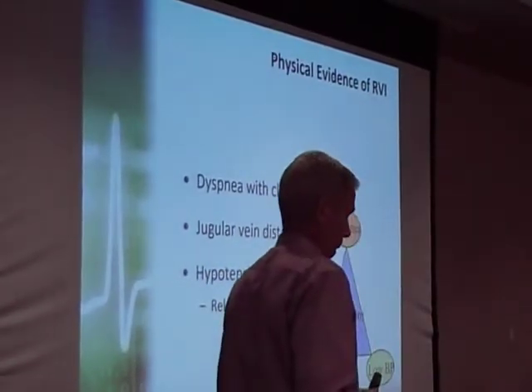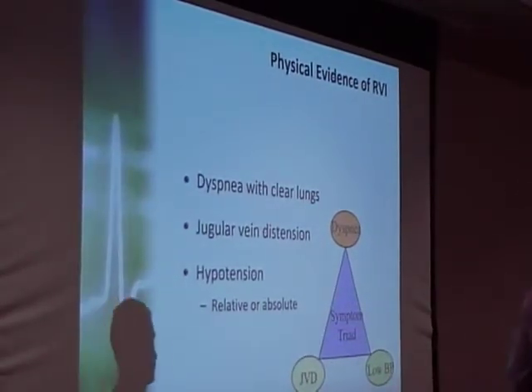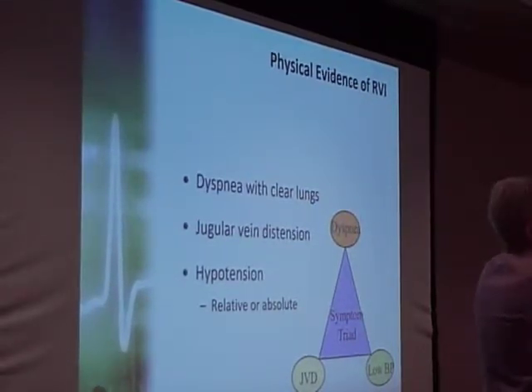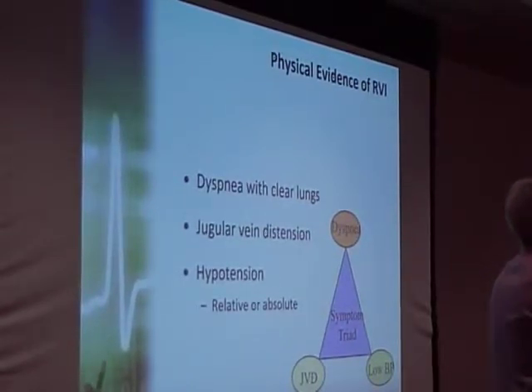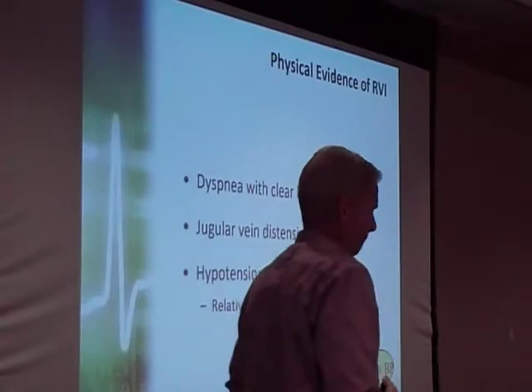Yes? So, with the regular 12 lead, it's the inferior MI, and we'll get the V4R. Why does that change V4, 5, and 6, as opposed to with a picture of a heart? So if you think about it, 4, 5, and 6 are looking at the joining areas of tissue, you're going to get changes probably in all 3 of them. I'm telling you, you don't have to put all 3 patches on. V4 will give you the most information. Just isolate it to one patch, and if you see an indicative pattern there, you should have a concern with that patient. Okay? So because they're all kind of the same area, that's kind of the source. Right.